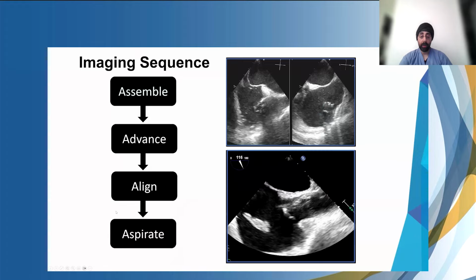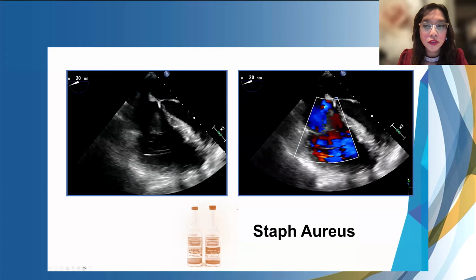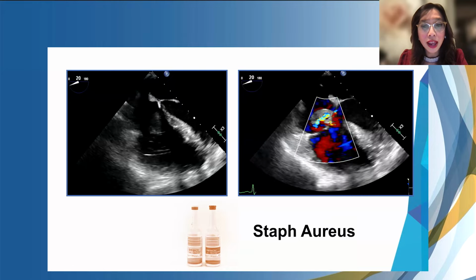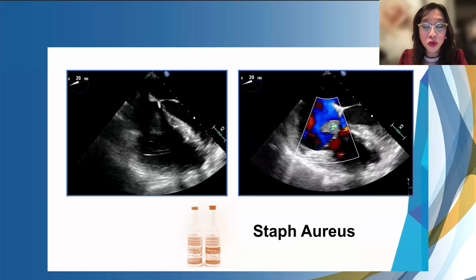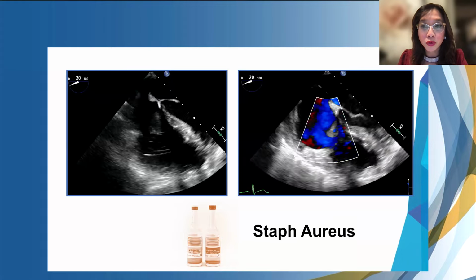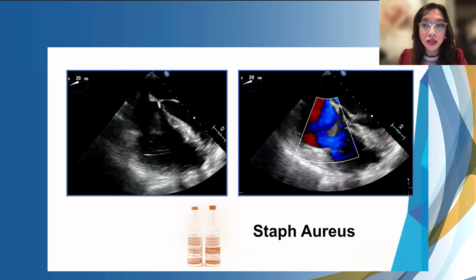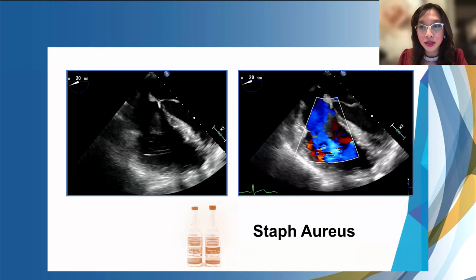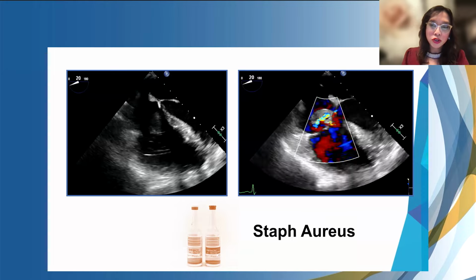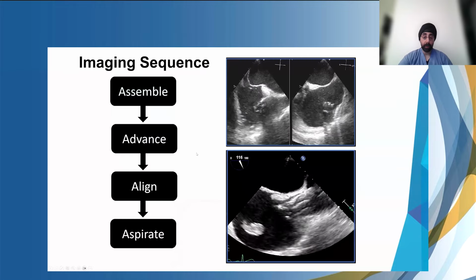You can see a decent amount of TR, would you say? Yes. What's significant here from an imaging standpoint, with the color Doppler, is that you can see the jet actually within the leaflet. So you know there's injury to the tricuspid leaflet, as opposed to the first case where there's not much injury just on the leaflet. Here the vegetation is affecting the leaflet itself. Would you agree with me, Sanjum, Abdullah, and Paul? Yeah, absolutely.